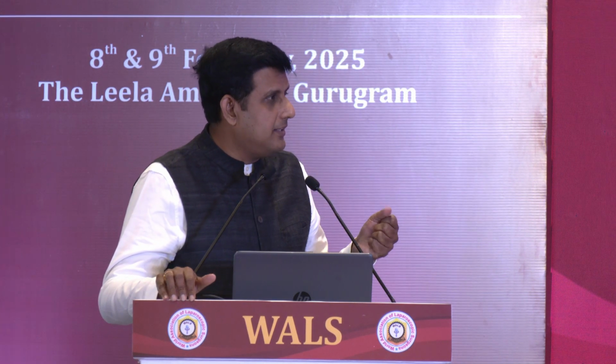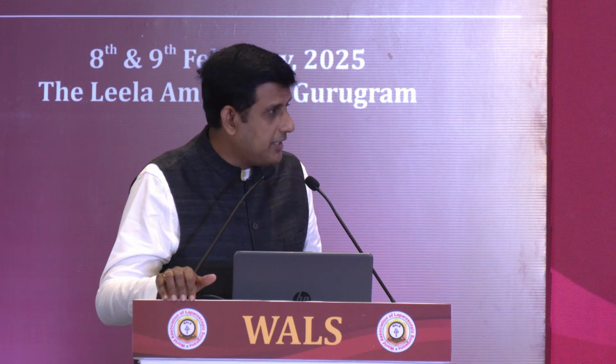So this is just diagnostic, or can any therapeutic procedure be done? Therapeutically, you can take biopsies, definitely. And I routinely do H. pylori testing for all patients. But the only thing is, foreign body removal cannot be done. Number one. Number two, if you have to do a sclerotherapy or banding, that cannot be done with this procedure. Okay. Thank you, Dr. Prabhudoss. Thank you, sir. Thank you.